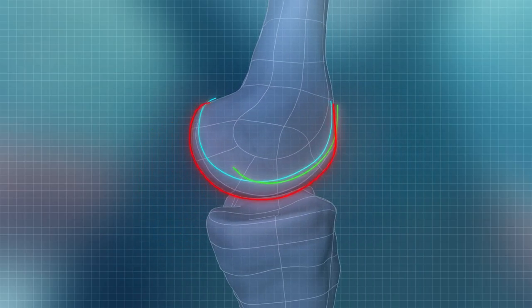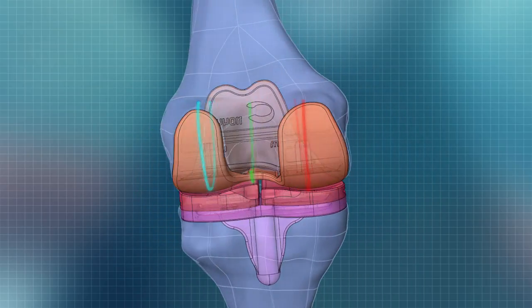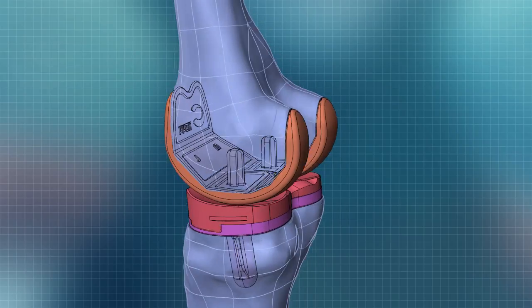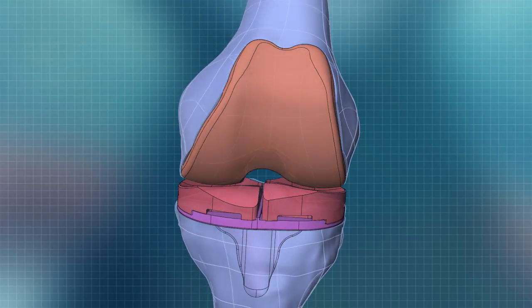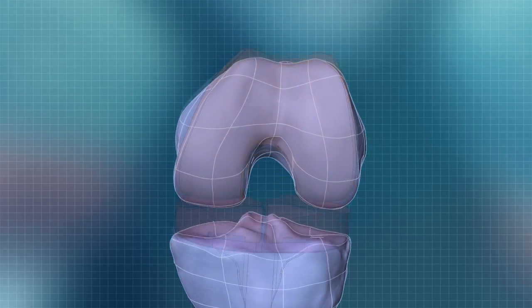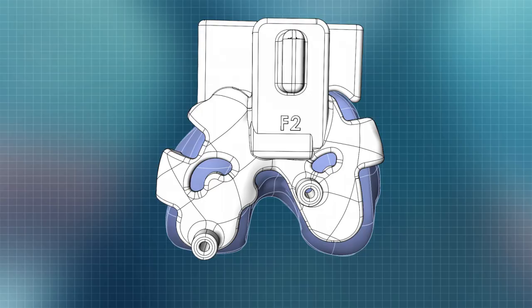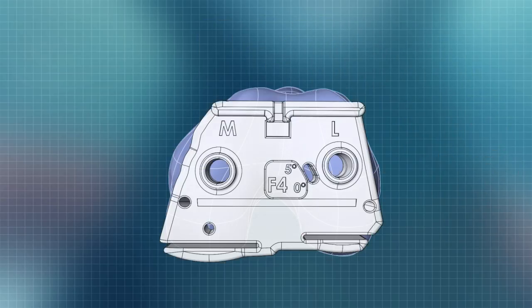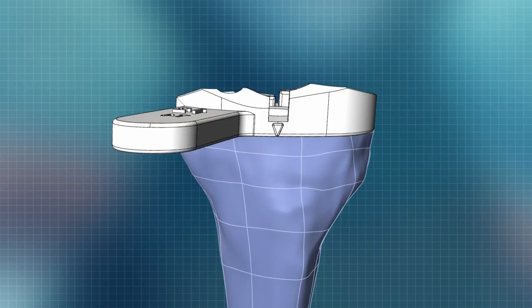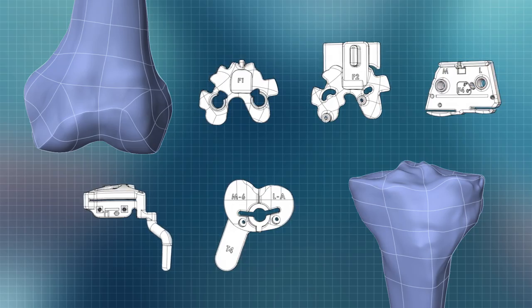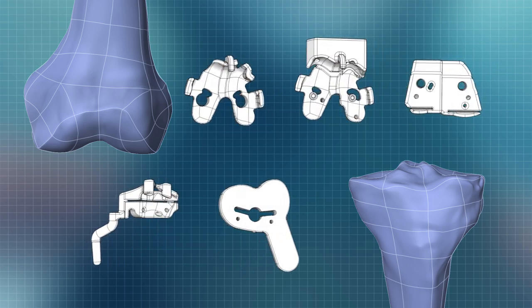The implants are designed to address common causes of patient dissatisfaction, including pain and unnatural feel. The same 3D model is also used to design patient-specific instrumentation for each step of the surgery, allowing for an efficient and simplified surgical technique.